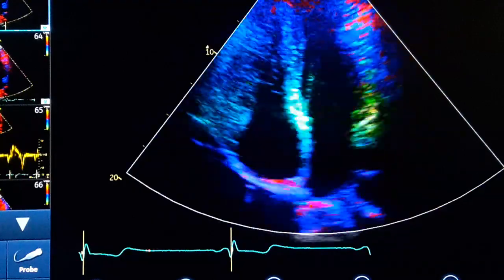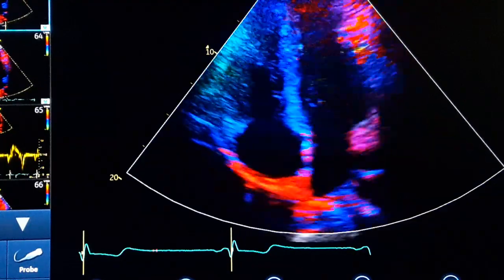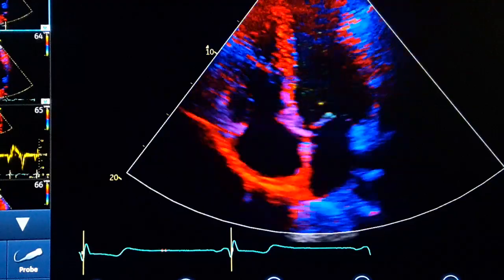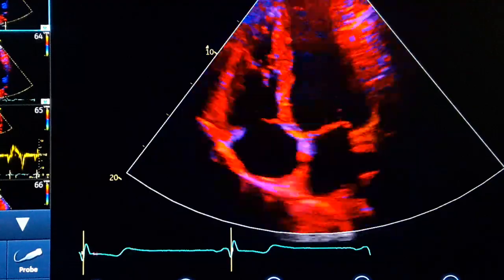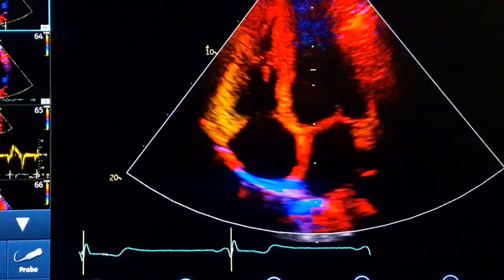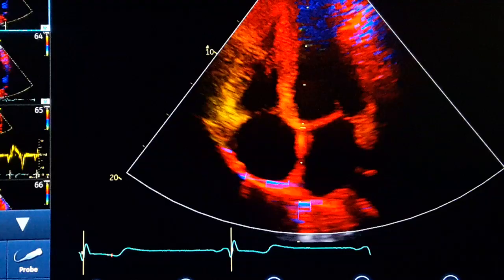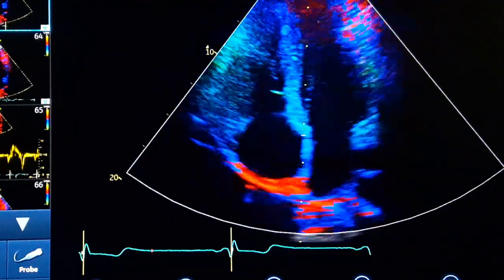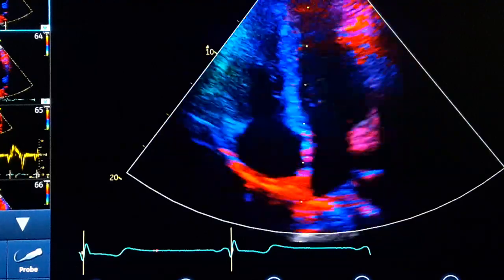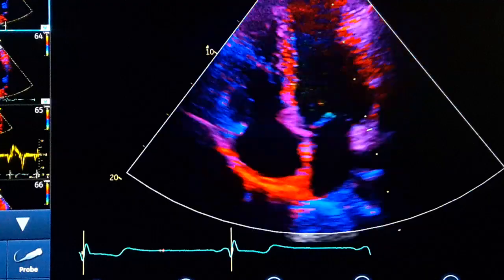In tissue Doppler, first we get the apical four-chamber view and then we select tissue Doppler or TDI. When we apply TDI, we place the sample volume in two locations: one at the medial annulus of the mitral valve, at the cross of the heart exactly where all four chambers intersect, and another at the lateral annulus.